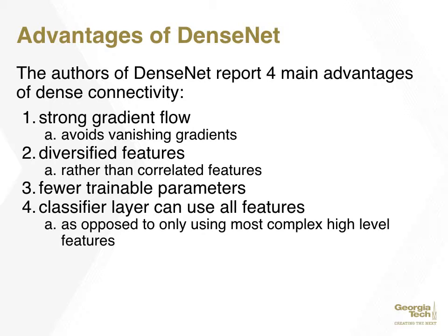The authors of DenseNet report 4 main advantages of dense connectivity. It avoids vanishing gradients, it produces diversified features rather than correlated features, it has fewer parameters, and the classifier layer can use all features, not just the high-level ones.